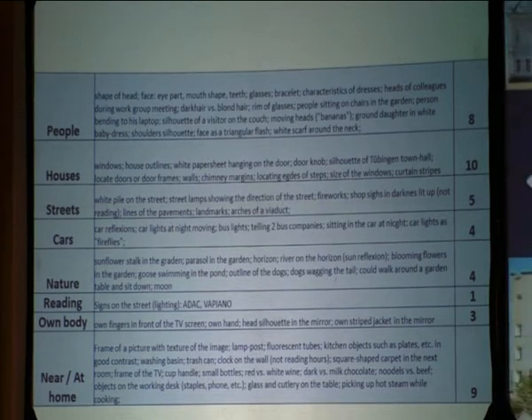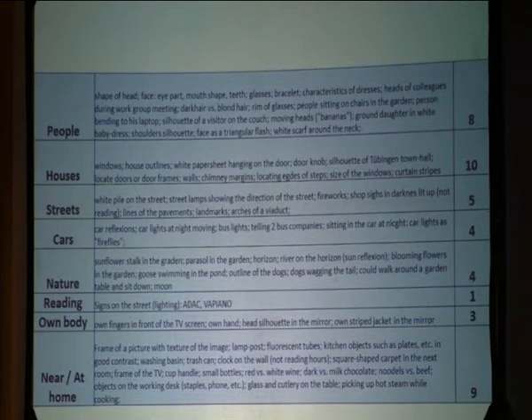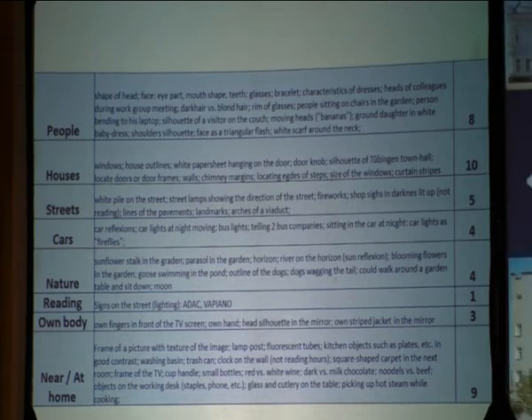You see a lot of things that the patients told us they could see after this implantation. They saw sunflowers in the garden, they saw car reflections. They saw shapes, they saw the head of the patient, the head of their partner, the teeth of their partner. A lot of interesting things, but that's not very systematic.